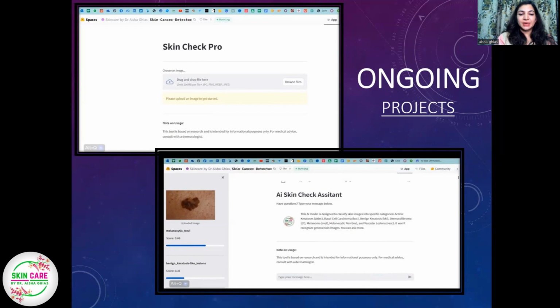Recently, in collaboration with some IT people, we have come up with a solution. Not everyone is good at dermoscopy or trichoscopy. But even if you're not good at it, you can at least capture an image, because capturing an image is quite simple. You just put the scope on, you put your phone on, and then you can capture. It's as easy as it seems.